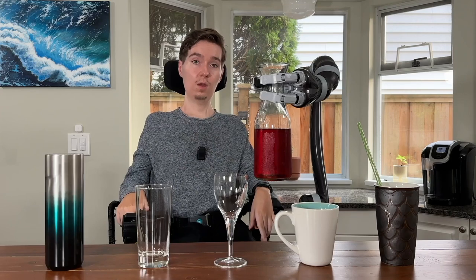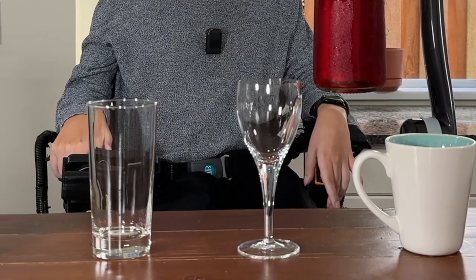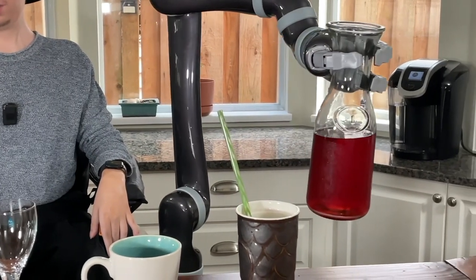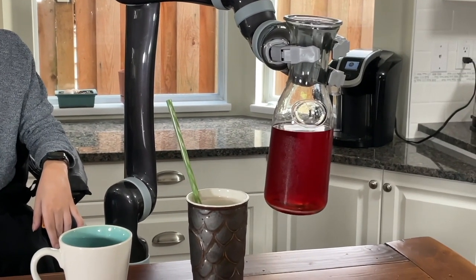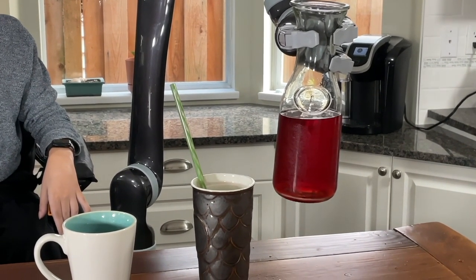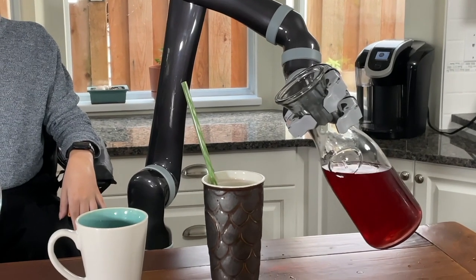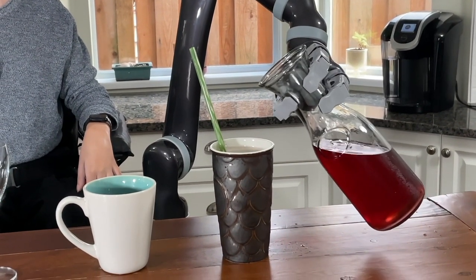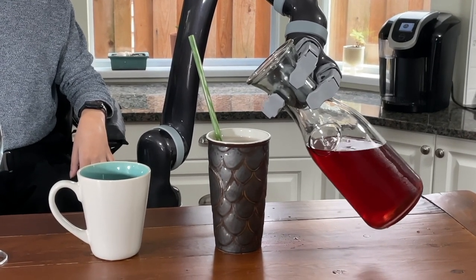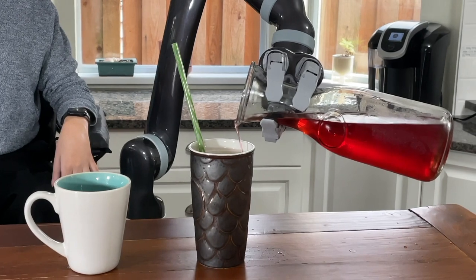Now let's pour ourselves a drink. Pouring your first drinks with Jayco is a very simple task, but let's just ensure that we're doing it slowly, especially for our first couple of times. I'm going to move the drink over to the side and adjust the angle of the hand just a little bit, then go into B2, which is going to be our primary mode for pouring. I can see I'm a little bit too far away from the cup, so I'm going to move in a little closer — this will be something you get better at with practice. Back in B2, I'm just rotating the wrist very slowly and keeping an eye on where it's going to be pouring.